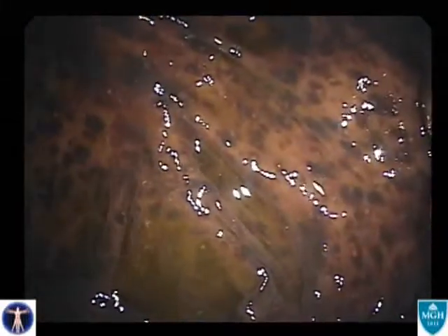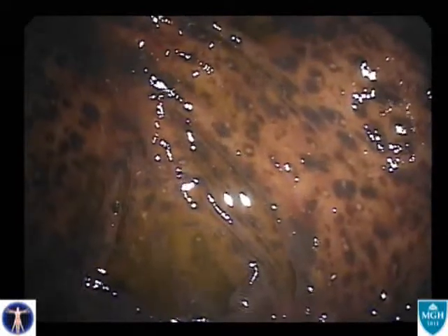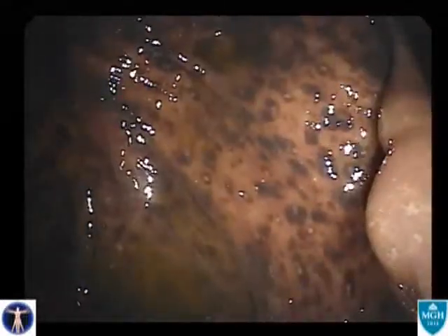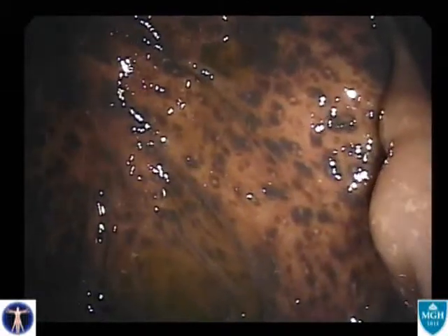Why is the small bowel completely spared of pigment? Does everyone who consumes these anthracene-containing laxatives develop congestion of lipofuscin, or is this a consequence of some metabolic or enzymatic defect? And finally, what is the relationship between these lymphoid aggregates and their halo of congested histiocytes? Who attracts who?